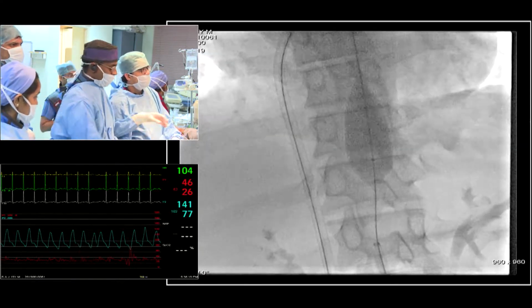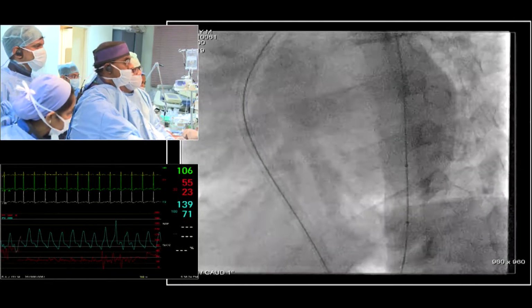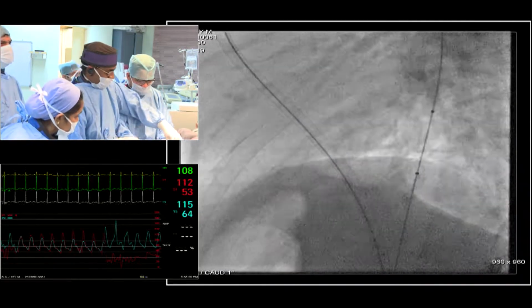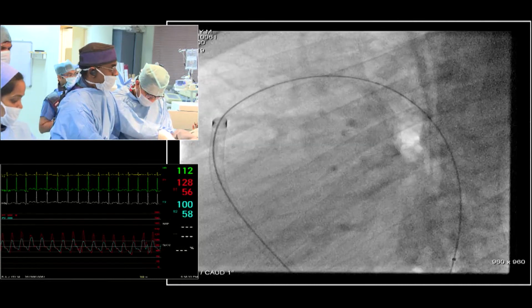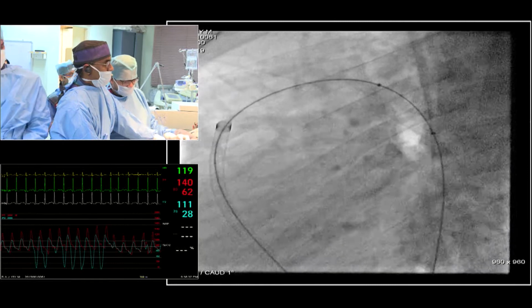Go back to lateral view. I think if the diastolic pressure in the PA is equal to systemic, that is certainly very worrying. Dr. Joe, the aortic pressure was 10 less than the pulmonary artery in systolic. In diastolic, they were the same.